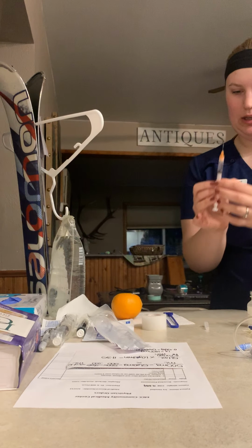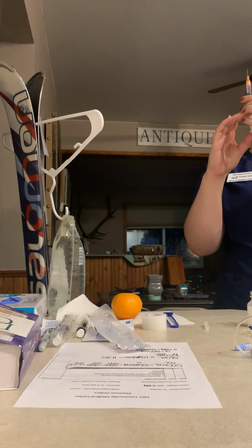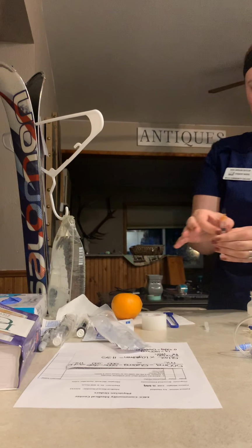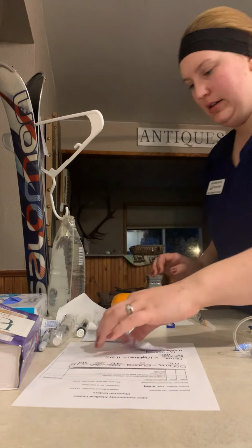Okay, checking for air bubbles. I'm going to go ahead and just scoop and recap. Put this to the side.